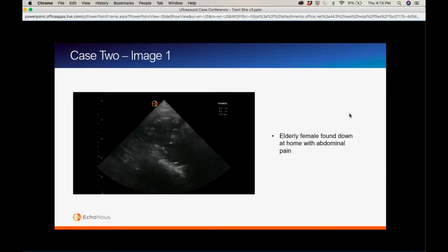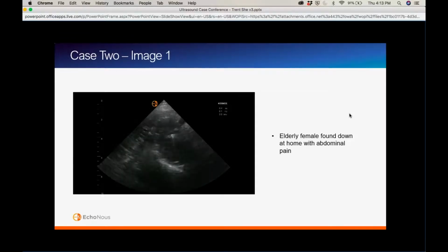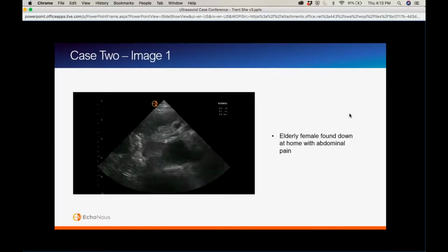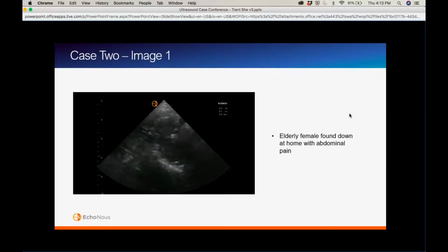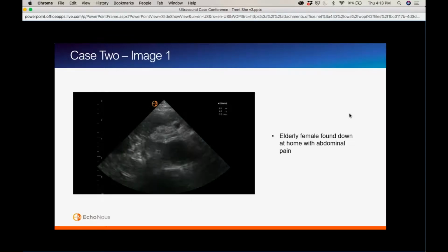And being that we had no information, one of the things we decided to do was get our bedside ultrasound and see if we could find a cause for this abdominal pain. I can't emphasize enough that with elderly abdominal pain, you can wait for the CAT scan, but if someone's not looking great, it takes 2 minutes to just throw the probe on their belly.